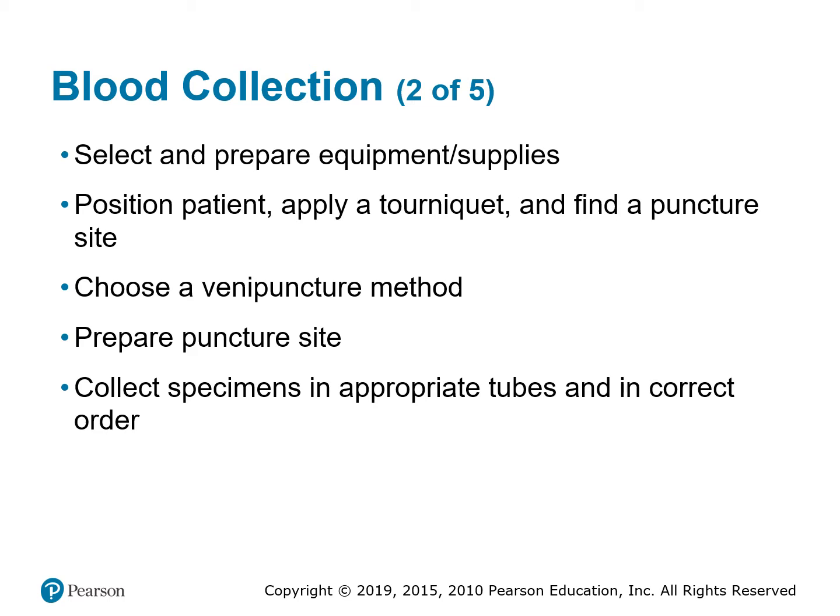The reason why we palpate is to see what direction that vein is going. Is it going at an angle? Is it going straight up and down? Is it going straight and then all of a sudden it curves to the left? Or is it going straight and curves to the right? We're trying to find out how the vein is traveling and what direction it's going in, so that when we do draw on that vein, we can pretty much hit it dead center on target.